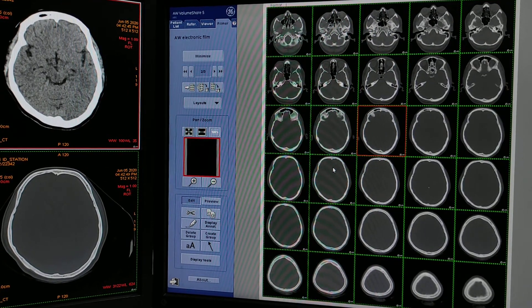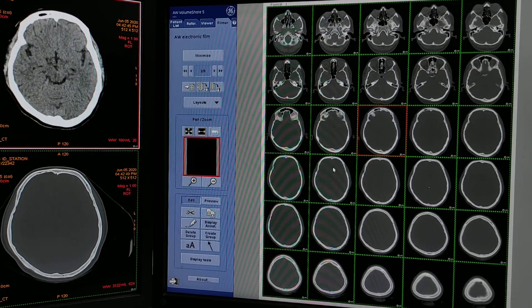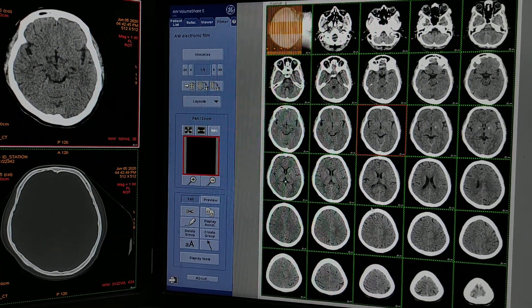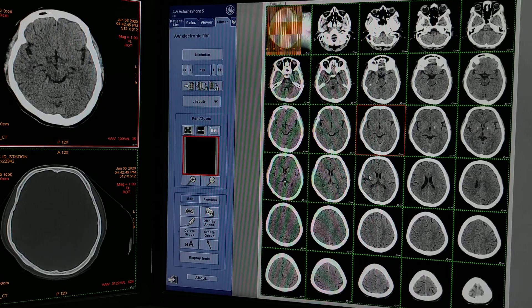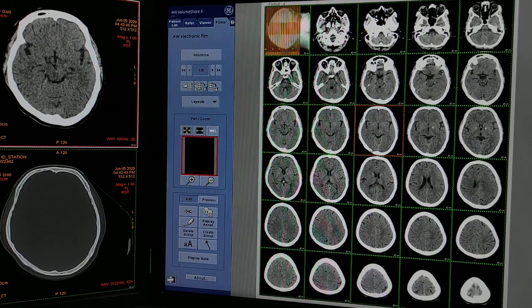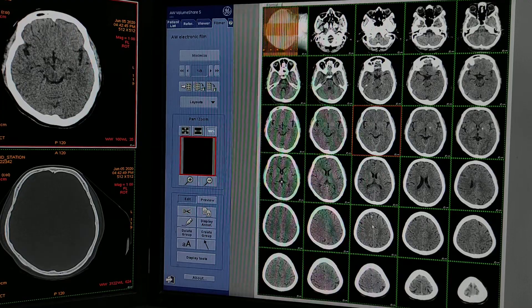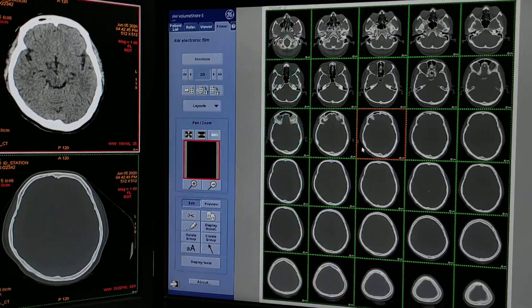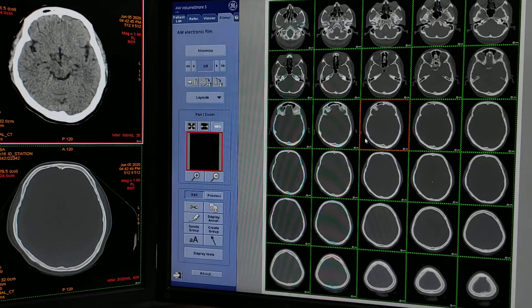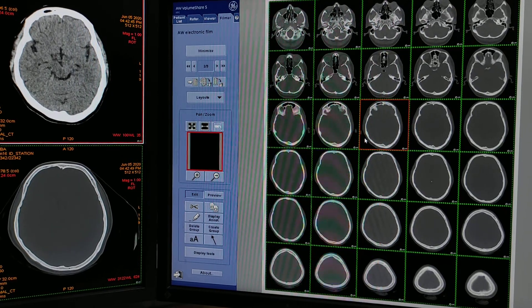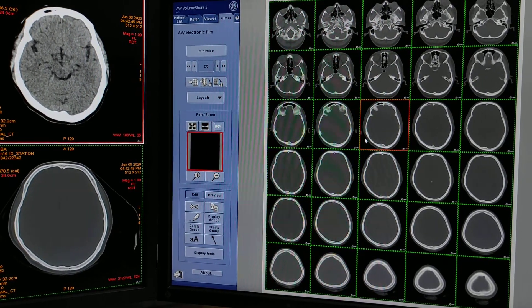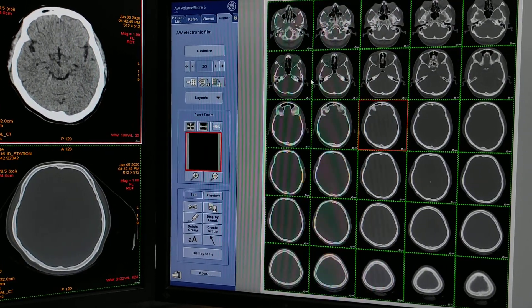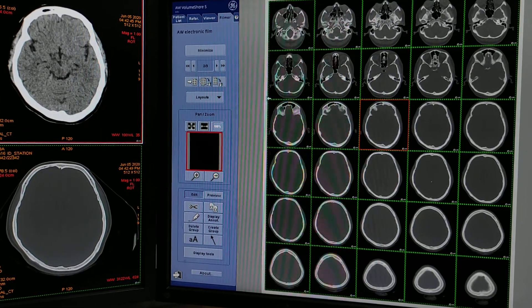If you are giving filming for CT scan brain plus contrast, the first film is for plain sections — same 5x6 format, select and simply add. The second film is for contrast. So you are going to give two films for CT scan brain plain plus contrast: first would be plain images and second would be contrast images — 5x6 format, 30 images for plain and 30 images for contrast.